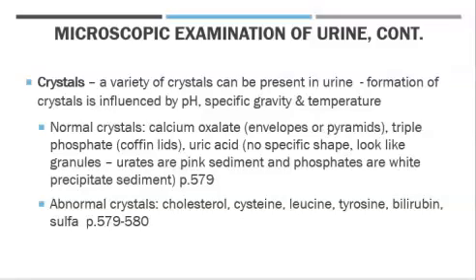Some people say they look like envelopes or pyramids, like we saw in the image earlier. Also, we have crystals that are known as triple phosphate. They look like little coffin lids. Also, uric acid crystals.